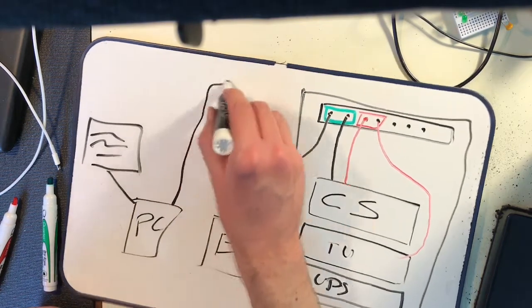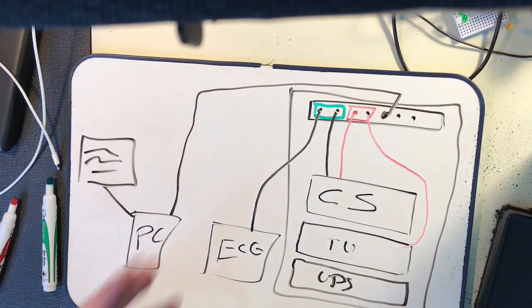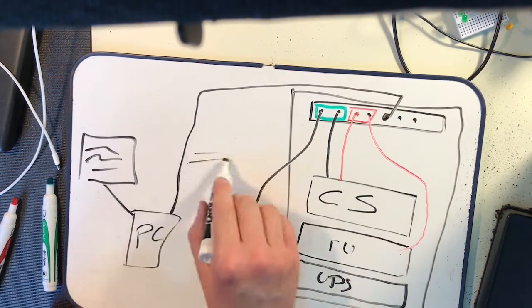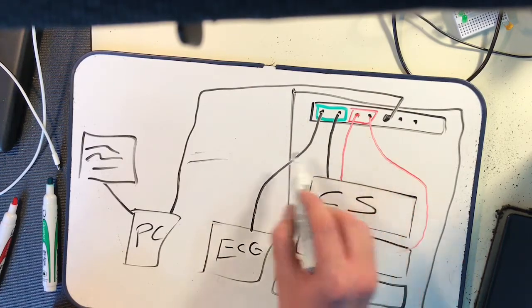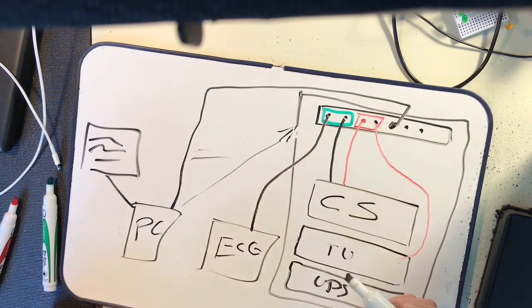The PC in this example would be connected to another switch port, which is a mirrored port, but that's a different video altogether. But to set up the VLANs on the switch, if you've had networking classes, you probably had Cisco. They did it all from probably the command line. This switch in particular uses a web interface, so you need to go on your PC and go to that web interface and configure it that way.